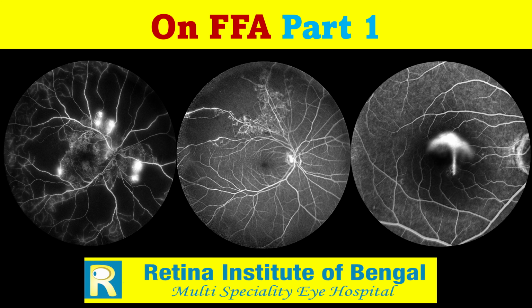We have already in the past shared videos of different diagnostics which we commonly use in retina. Especially, we shared a video on OCT and OCT angiography. Continuing with those same type of videos today, from today I start sharing a series of videos on FFA.